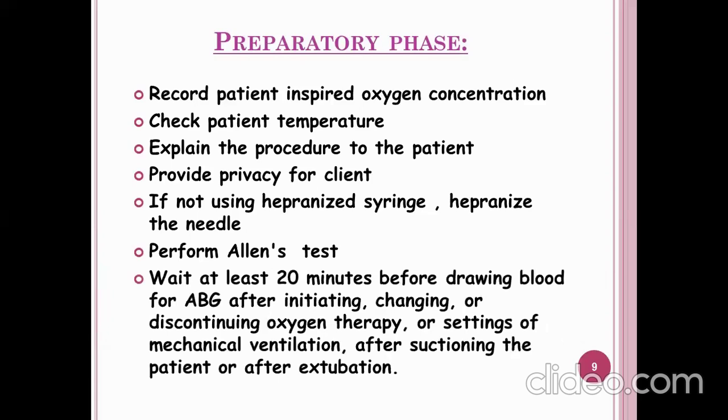Wait at least 20 minutes before drawing the blood for ABG after initiating, changing, or discontinuing oxygen therapy, after setting of mechanical ventilation, after suctioning the patient, or after extubation. So you have to remember this in the preparatory phase.